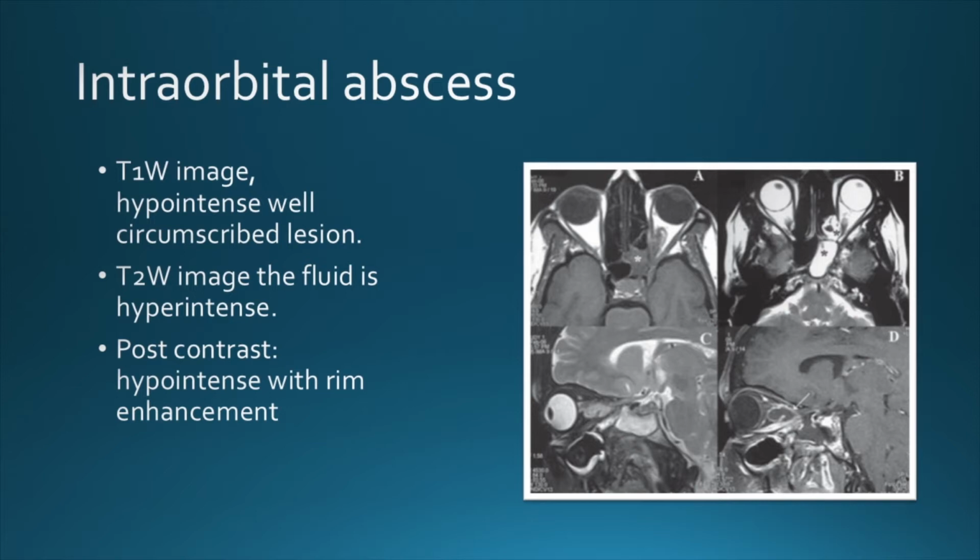You need not even give contrast. You have that particular sequence. Contrast is given basically to look for cavernous sinus thrombosis, to outline the abscess. What is the sequence? Diffusion weighted.